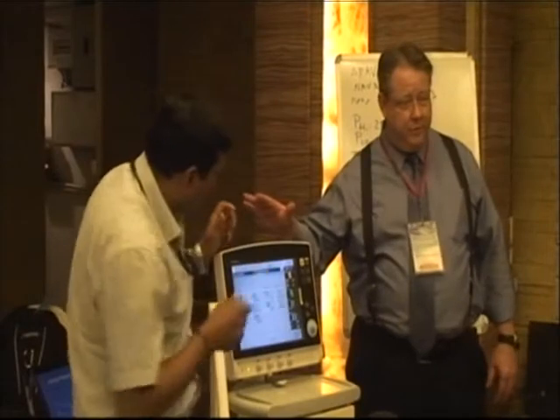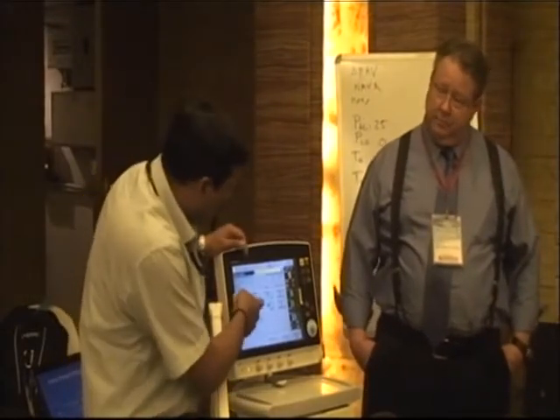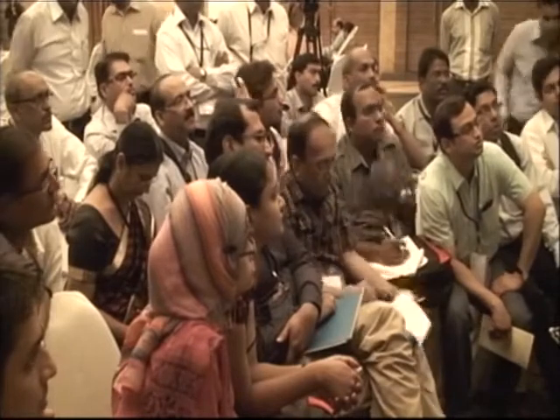This is just inverse ratio ventilation when you're not spontaneously breathing. We have not set any respiration rate in this. Depending on your T high and lower CPAP time, that will be your respiration rate. So I have set 3.5 and 0.5, so the total cycle becomes 4 seconds. Your respiration rate becomes 15 breaths per minute.